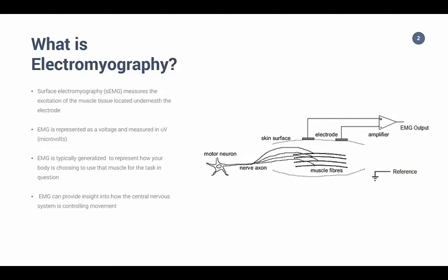Altogether, it is a well-organized effort of the brain and 28 major muscles to control the trunk and limb joints to produce the forces needed to counter gravity, propel the body forward, as well as countless other functions through which we can interact with the world around us. EMG allows us to see inside the body and understand how well the brain and musculoskeletal system are coordinated.